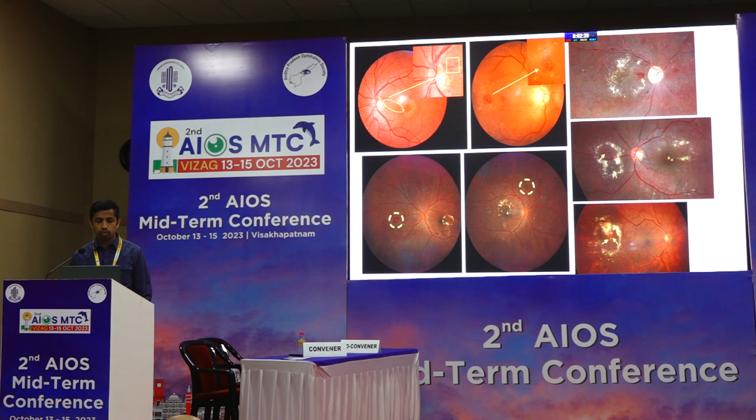These were some of the fundus pictures of our patients. 1 patient had a perifoveal RCM. The other patient had an RCM along the papillomacular bundle. In the last pictures you can see multiple RCM lesions.